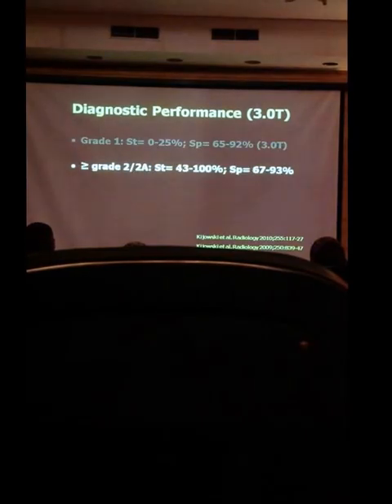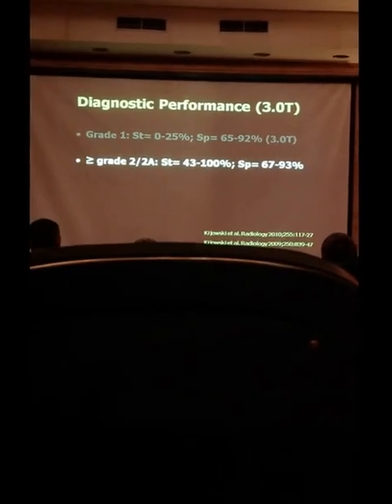And when we talk about real defects in cartilage, like grade 2 or grade 2A or higher in both classifications, Outerbridge and Noyes, we are better. And of course, for higher grades of cartilage pathology, we're even better when using MRI.